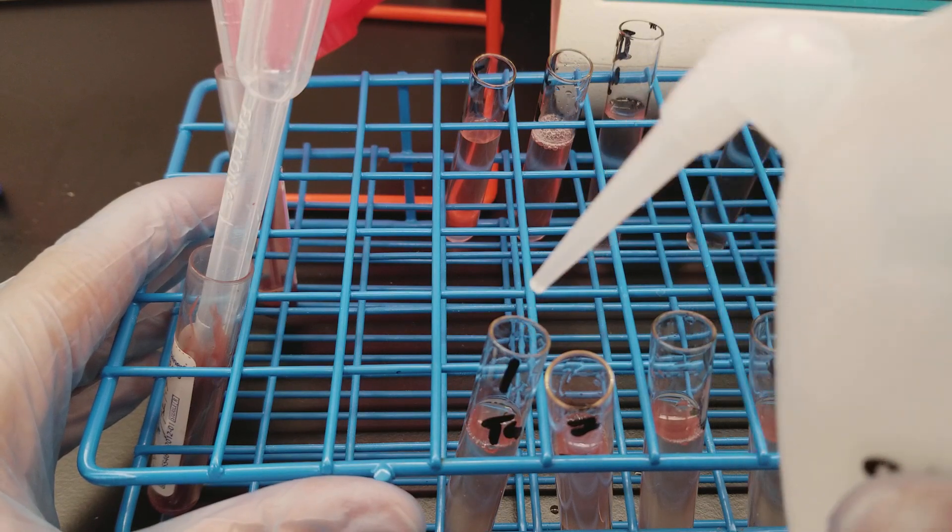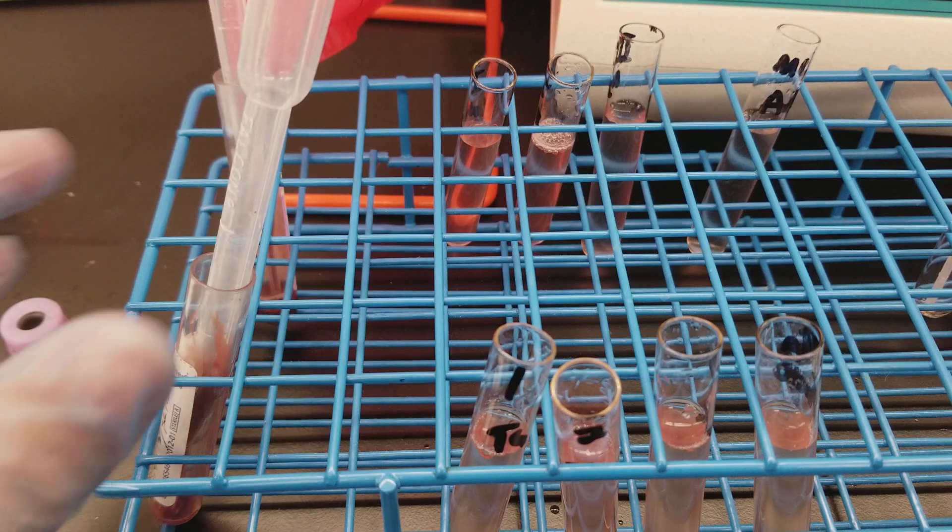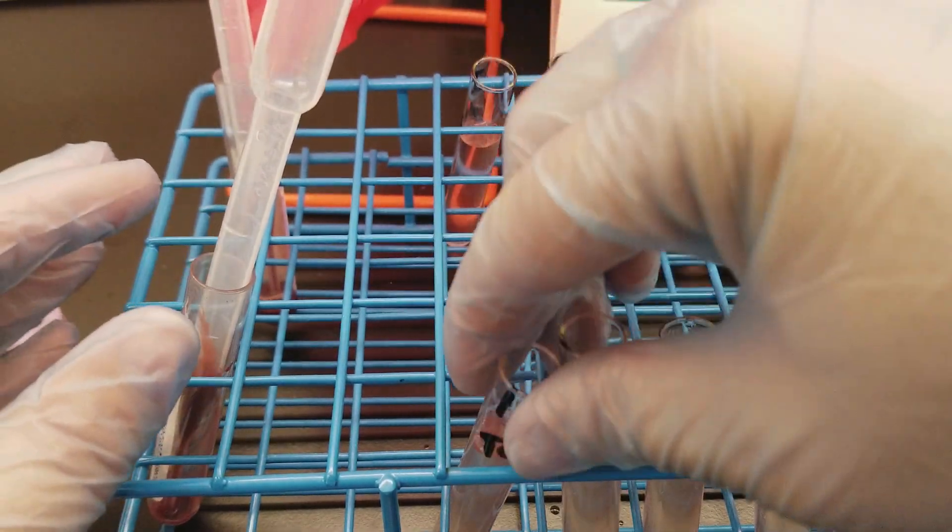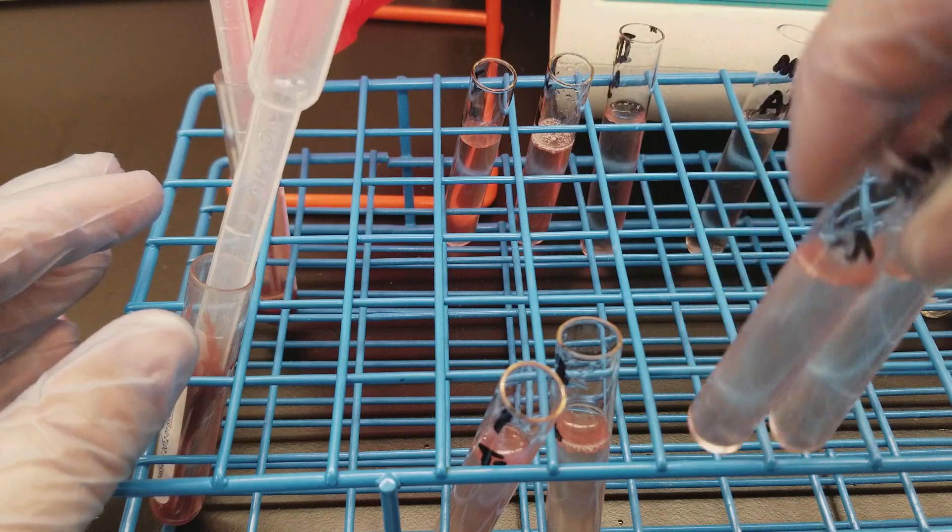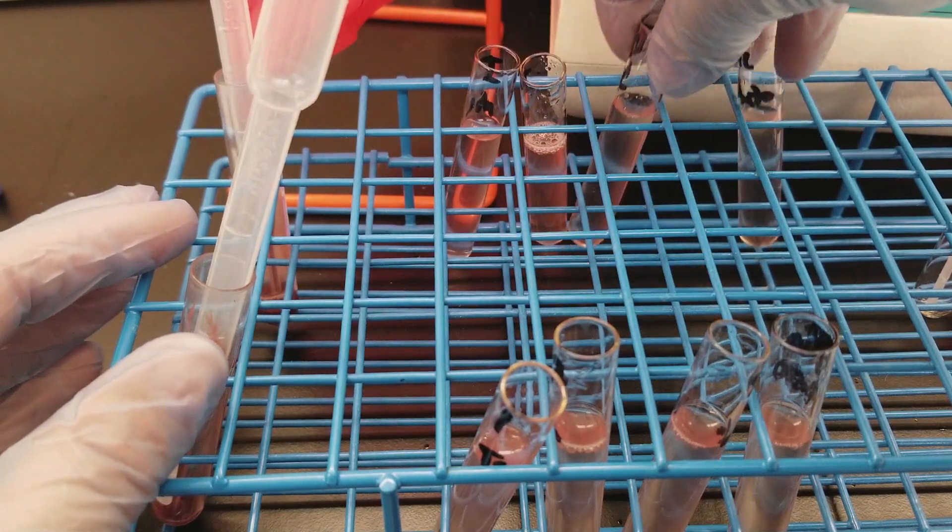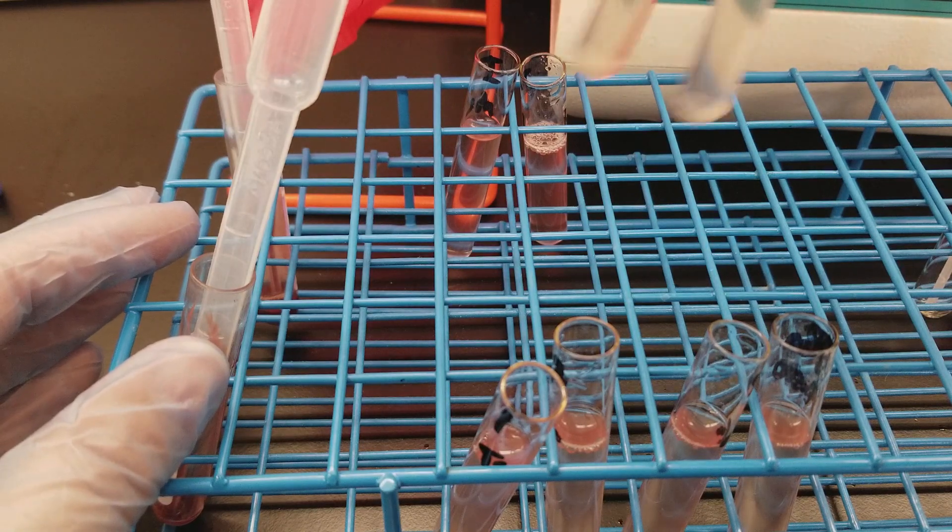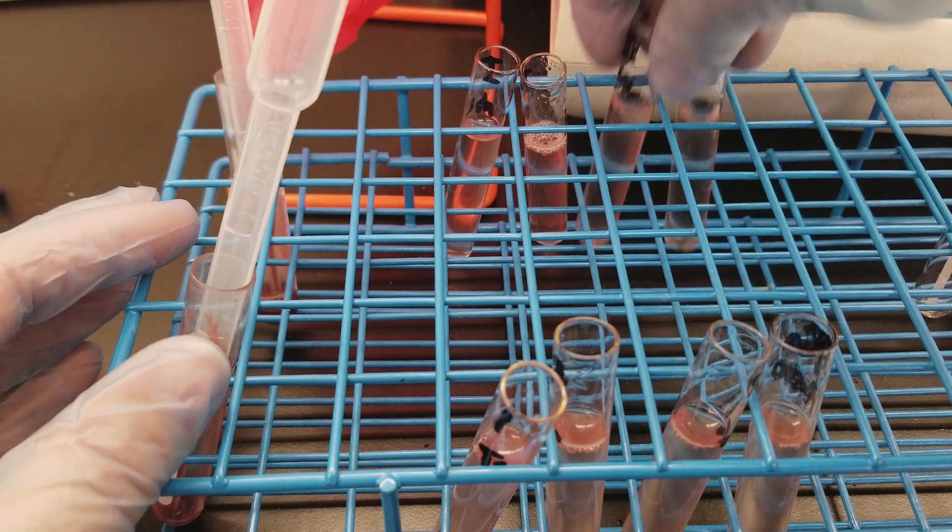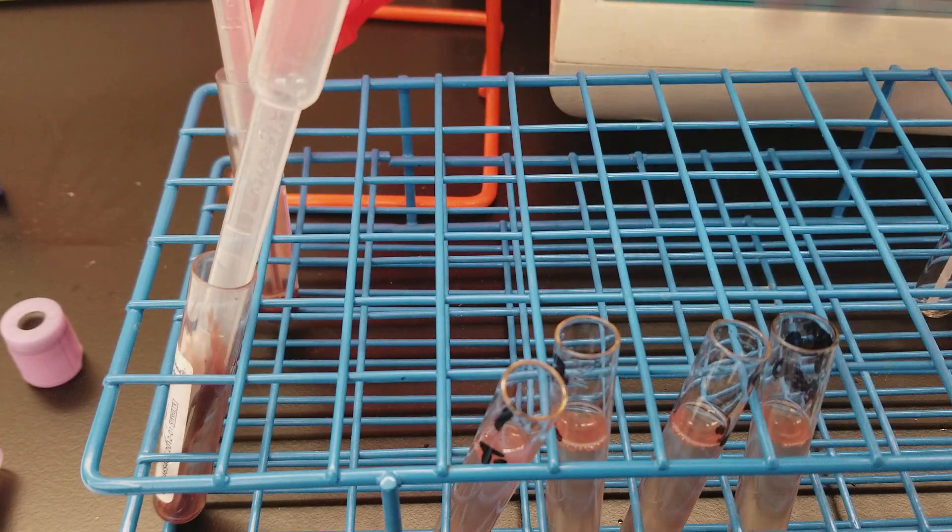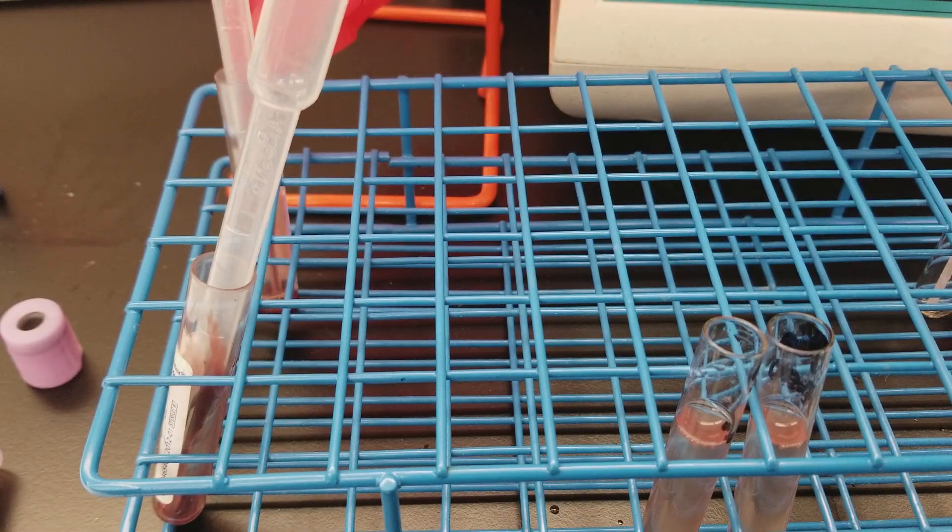We gently re-suspend them and put them into the centrifuge. Then we bring them out, dump the saline off the top, keeping the button at the bottom. And then we do the process over again. So we're going to do that three to four times.